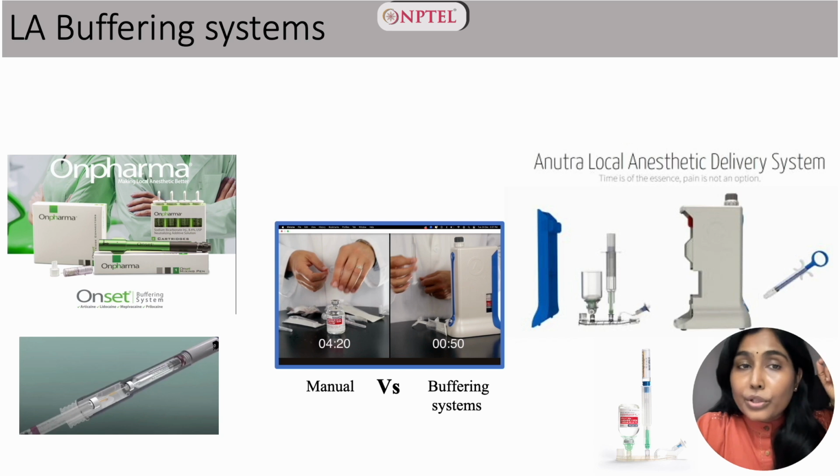But when you don't want to do the buffering manually, well, you could use the automated buffering systems. Popular ones are the OnPharma and the Anutra systems. These are very quick. Buffering occurs in seconds. These are simple chair-side devices wherein the buffered solution is more reliable and predictable, and this is going to keep your practice on time and on schedule. There's no need to change your syringe or learn a new injection protocol. Once buffered, you place a local anesthetic cartridge in your own syringe and give the injection using your own injection technique. So you must consider using these systems.